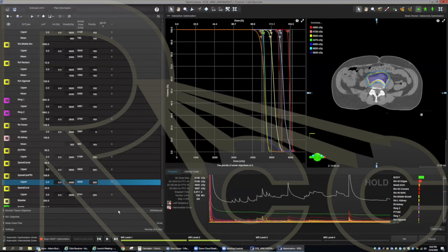We would start escalating things and having overlap of organs, even lower doses, and our patients were just getting really low toxicities. So in particular cases where disease was a little bit more aggressive, our doctors were happy to escalate because the toxicities were just so low.